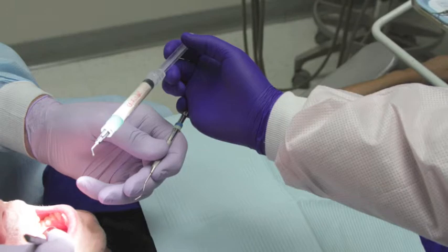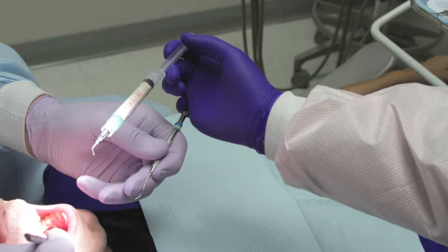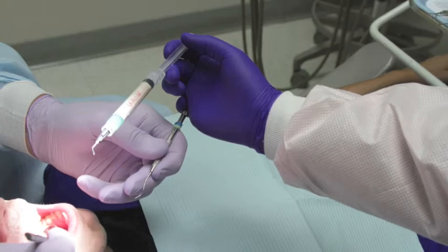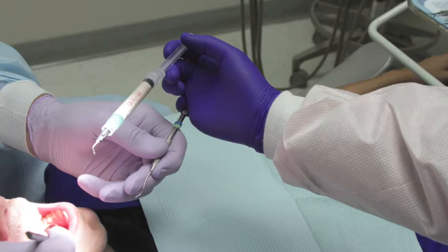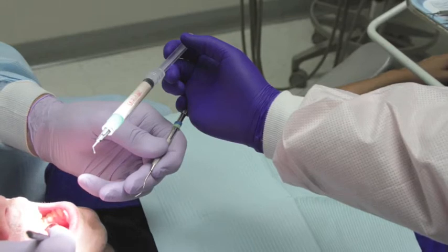Remember, the key feature though is that you transfer from the little finger to pick up an instrument. You pass onto the forefinger of the doctor. Make sure that the middle part of the instrument going to the doctor is free so that they can grasp it. With this, you should be able to have a good transfer, and you and your doctor should be able to work very smoothly together.